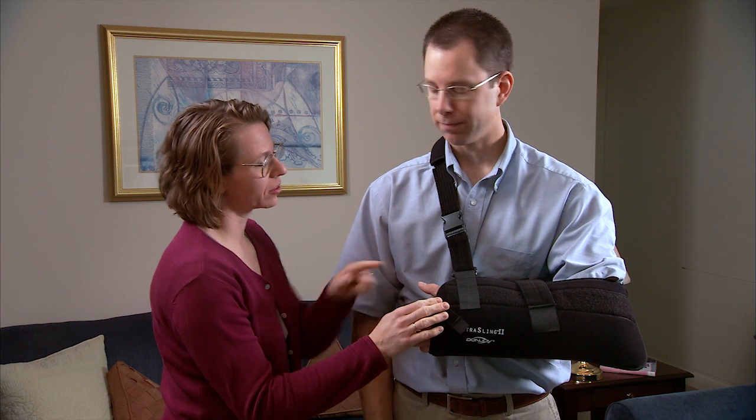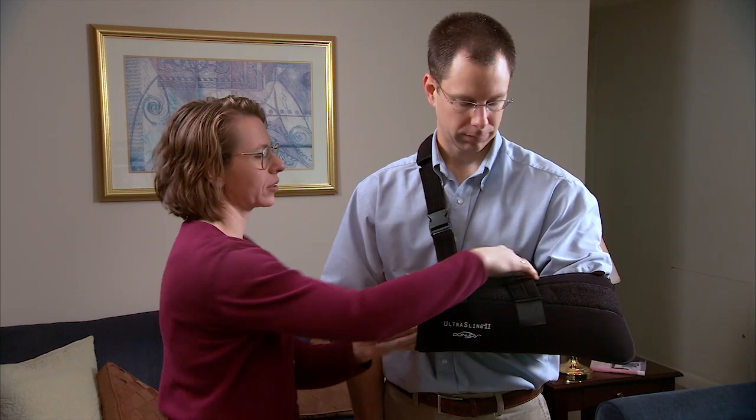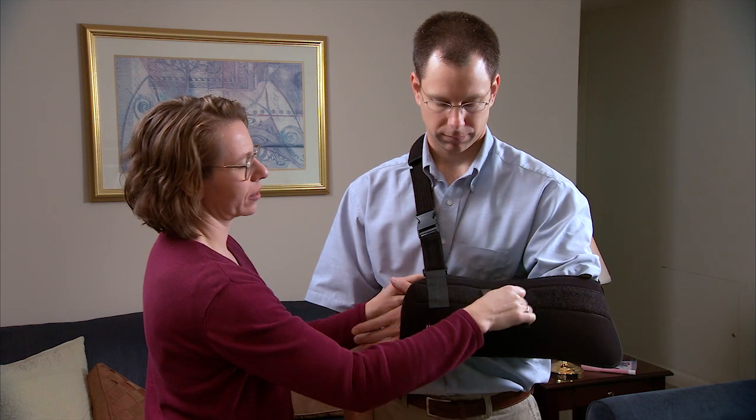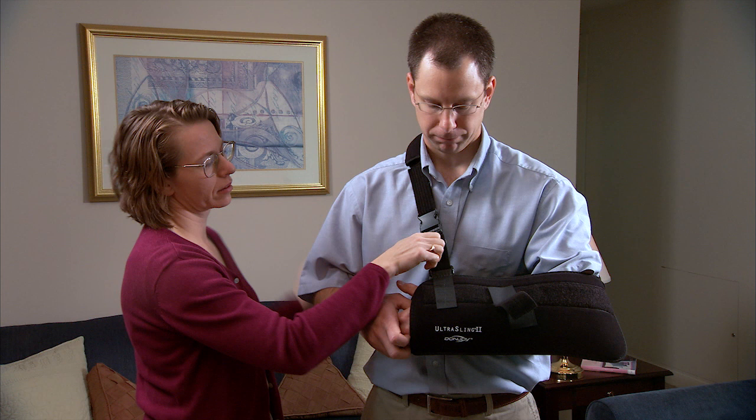To remove the sling, your helper removes the thumb strap, then the strap holding the sling closed. Your helper unbuckles the waist strap. Hold the hand of your healing arm to support that arm. Keep the muscles in your healing shoulder and arm relaxed.